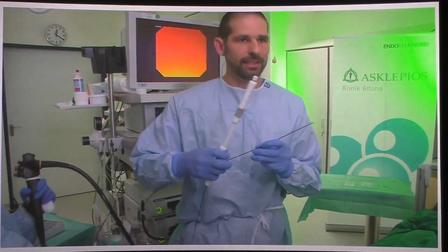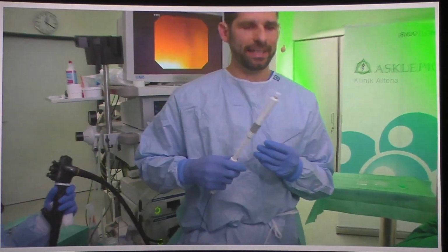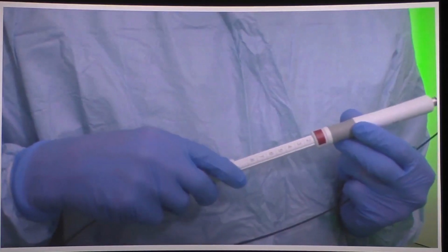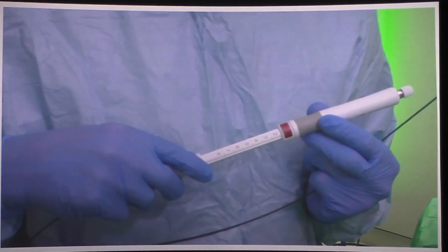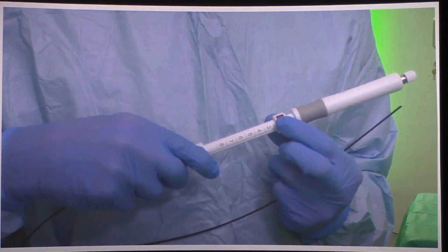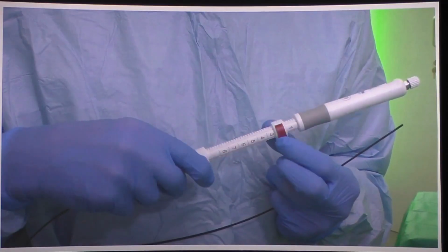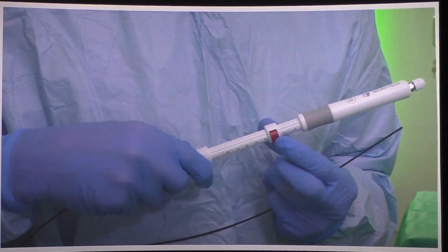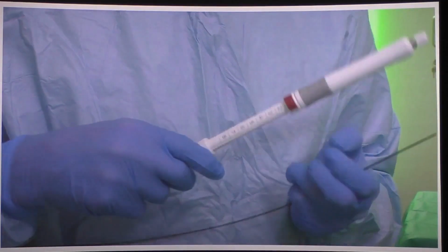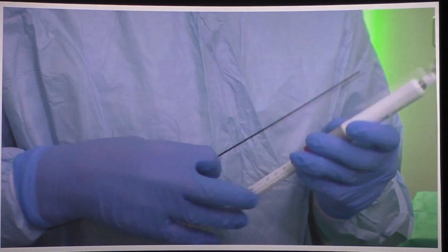It is a Mictotech needle, the so-called trident needle. It has 2 additional features other needles don't have. It doesn't have the typical closure with needles, but this is a click closure system. You can lock it and click it, and it automatically clicks out again if you press it again.